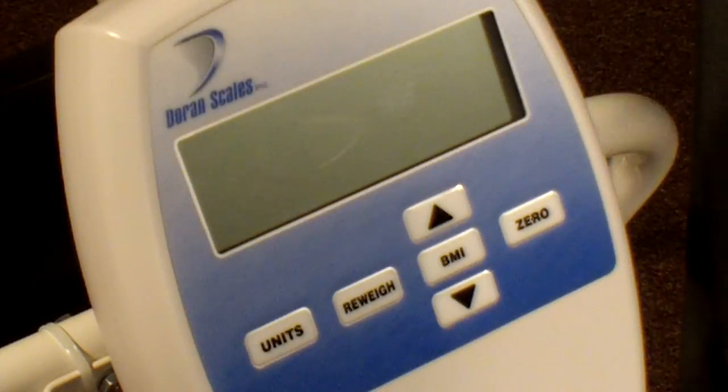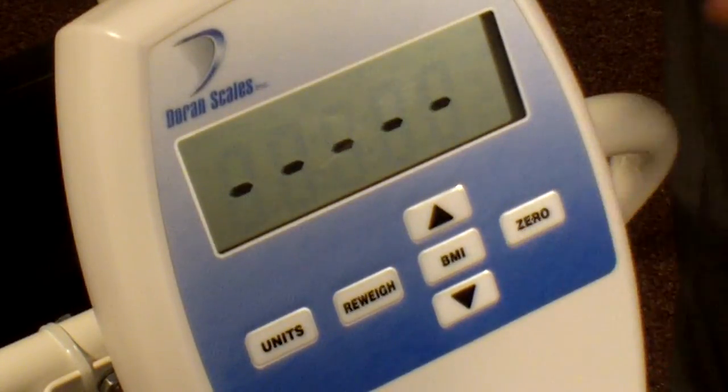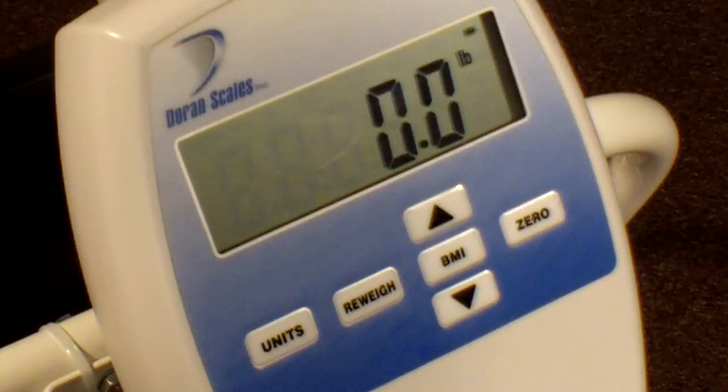Follow these easy steps to weigh patients with the DS8150. First, lock all four casters to make sure the chair scale will not move as the patient enters or exits the scale. Then press the zero button to turn it on and zero the scale. For easiest access from the front, lift the foot rests and have the patient sit in the seat.